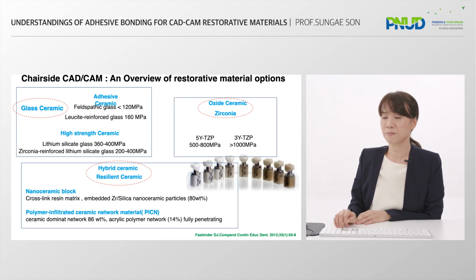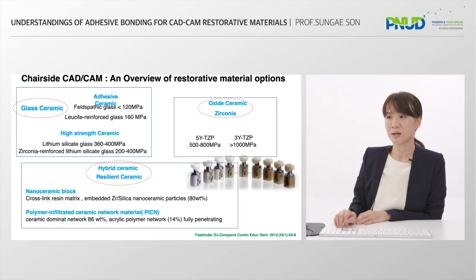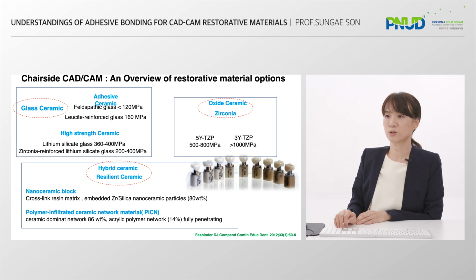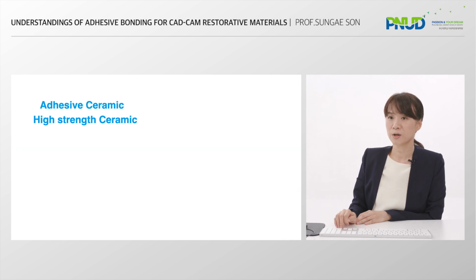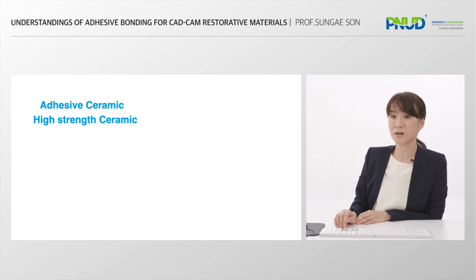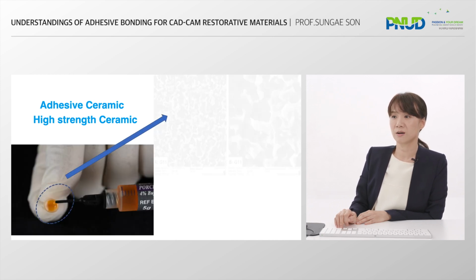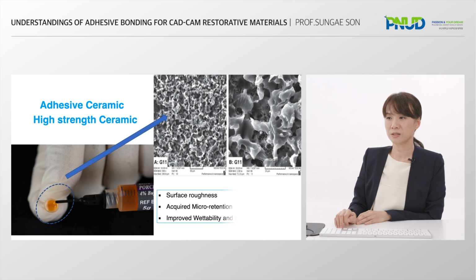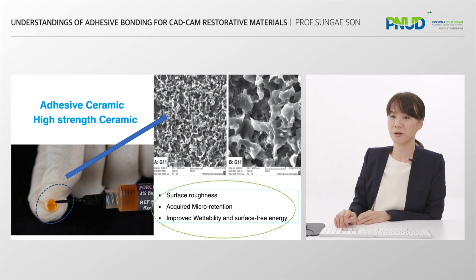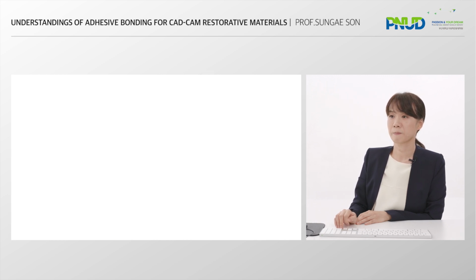Among CAD-CAM restoration materials, silicate ceramics include feldspathic glass, leucite-based ceramic, and lithium disilicate ceramic blocks. Their greatest feature is that they are aesthetically superior, and when hydrofluoric acid is applied, the surface becomes rough and irregular. This leads to greater adhesion when resin cement is applied.